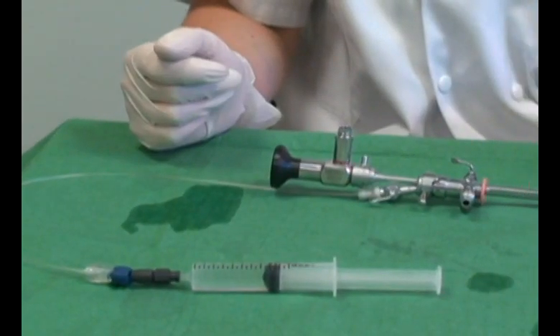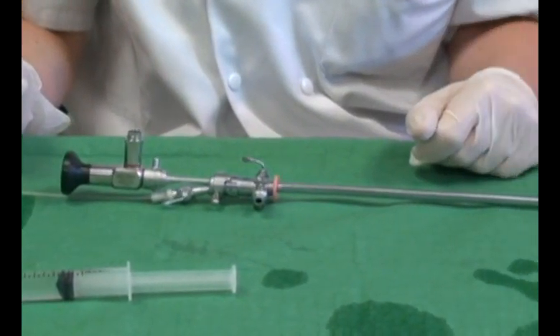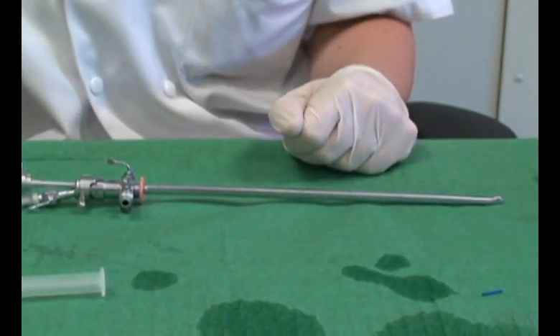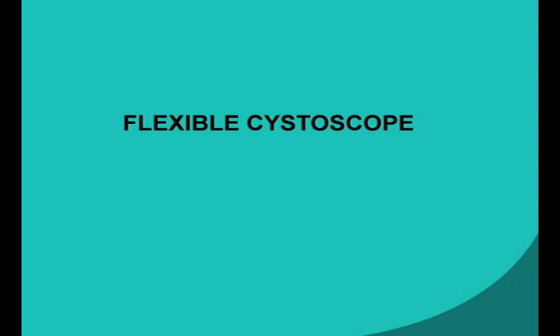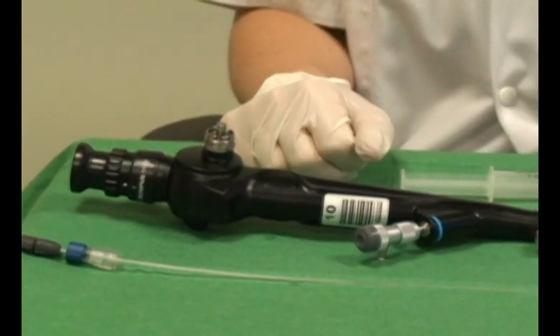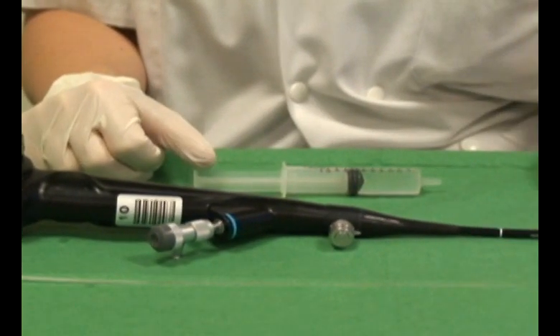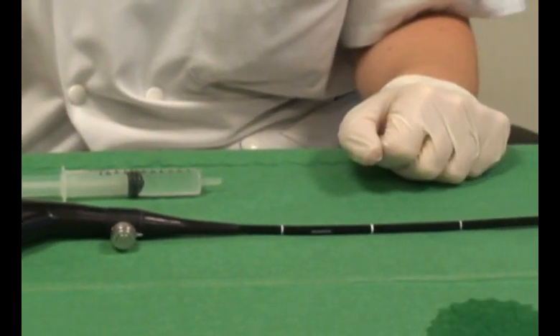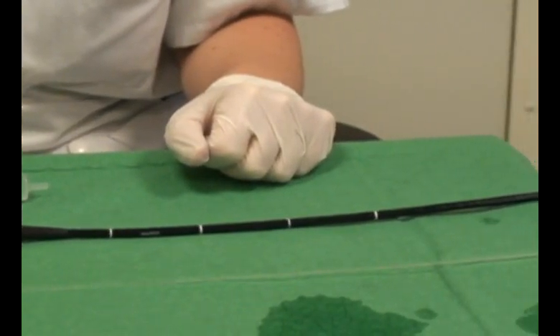The system comprising of the cystoscope and the needle is now ready. With a flexible cystoscope, we need only the scope and the needle. For the demonstration, we will use an Olympus cystoscope and need to use a 70 cm Bonee needle.